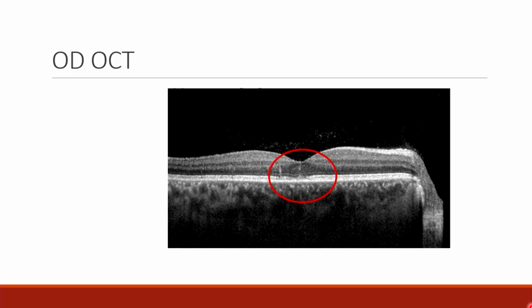So there are fresh postgraduates also, they might not know ELM or EZ, I'll say the full forms, ma'am. Yes, ma'am. The external limiting membrane is a little irregular, which is this layer. The outer 4 hyperreflective layers, the first I'm talking about is the ELM, and then just below that is the ellipsoid zone and the interdigitation zone. Both of them are irregular and hazy in appearance. The outer RPE and the Bruch's complex in this OCT appear intact and are not pathological.